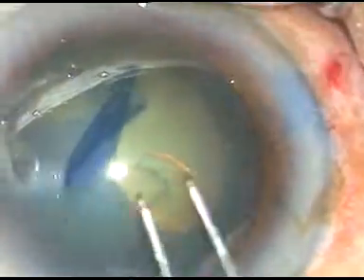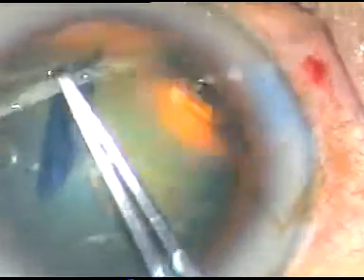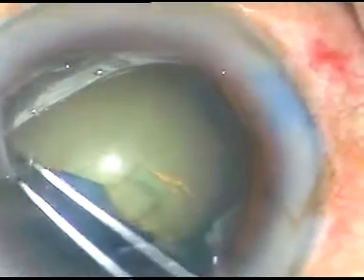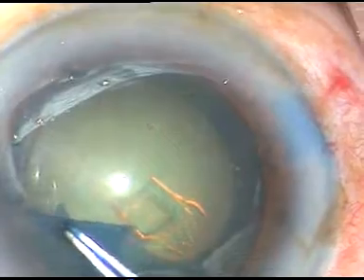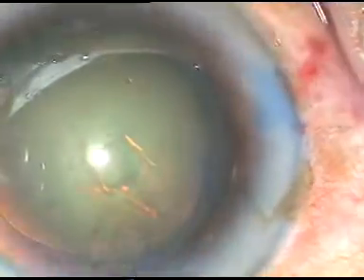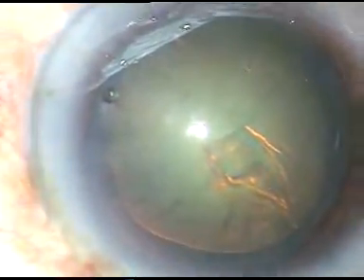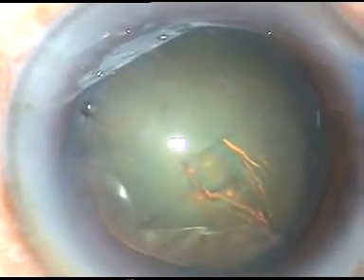The capsule is held and I go anti-clockwise, trying to remain at equal distance from the dilated pupillary margin. The rhexis is now completed — this is a fairly round, large rhexis. The rhexis size is about 5.5 to 6 millimeters.